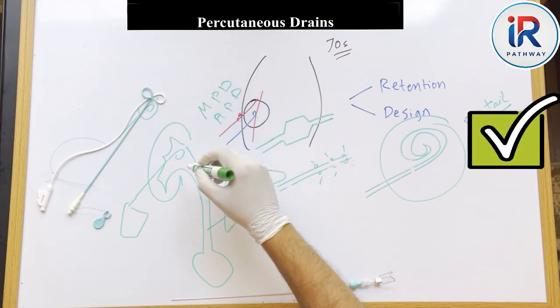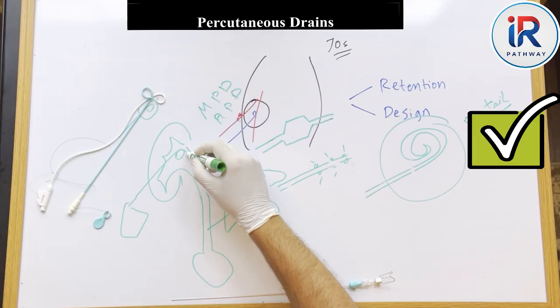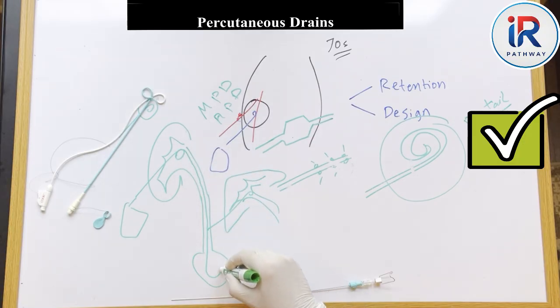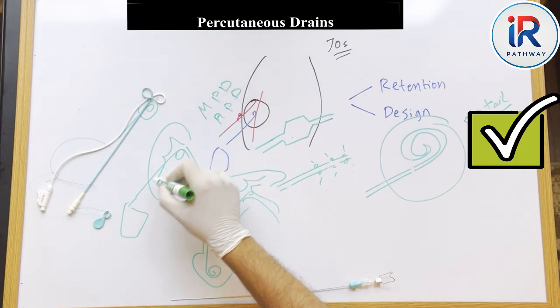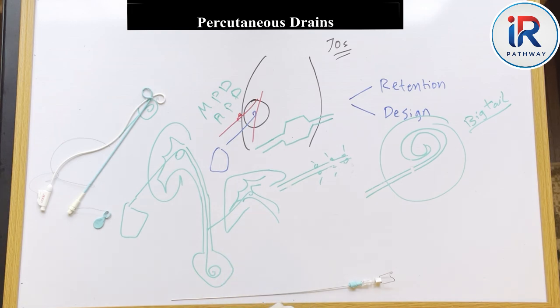Okay, the nephroureteral stent or the nephroureteral drain. It has two loops. One lies in the renal pelvis, and the other loop extends down into the bladder. This way, it can drain outside or drain urine down to the bladder, provided, of course, that there is no urine output obstruction. So, what is the advantage of such configuration?